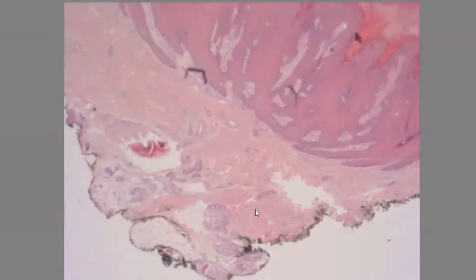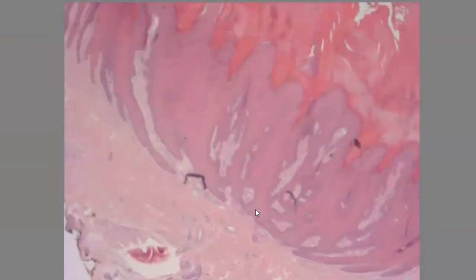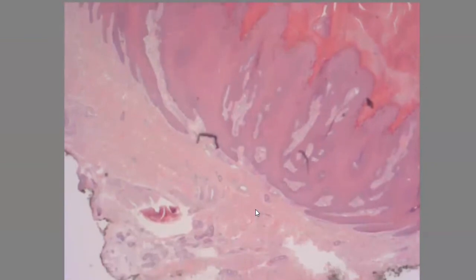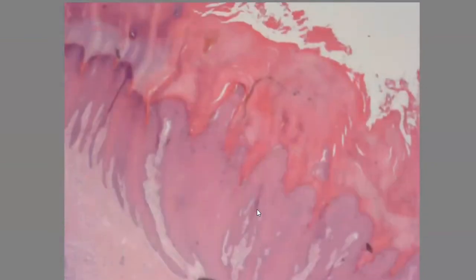So let's describe the Verruca vulgaris on low power first. From the top you can see here this hyperkeratotic layer, and you can also see this parakeratosis, which is retained nuclei, and you can appreciate this hyperpapillomatosis that is present on the epidermal surface.